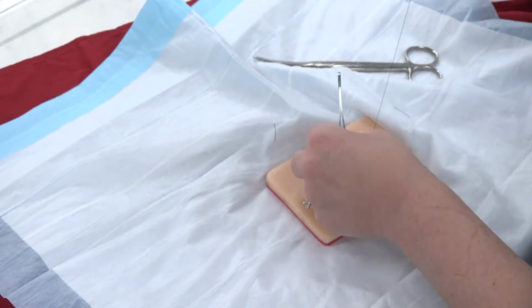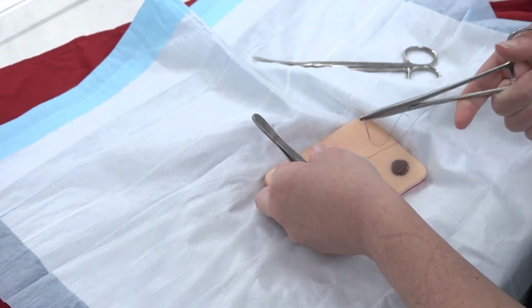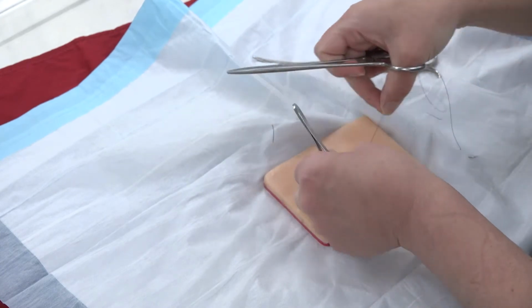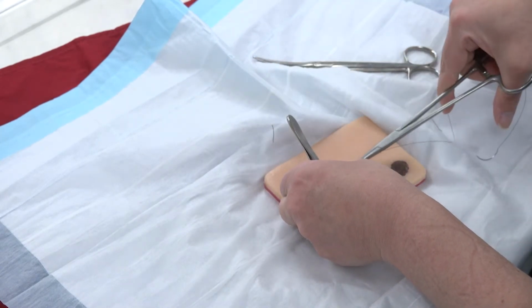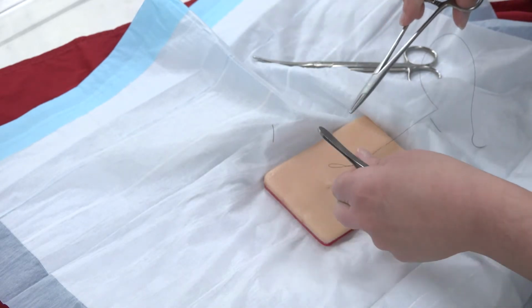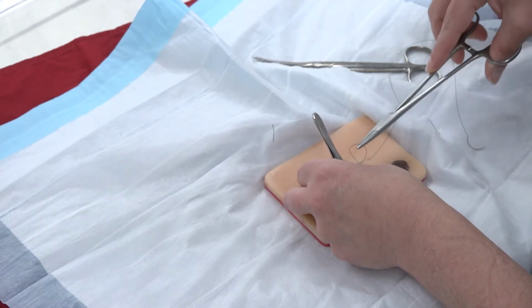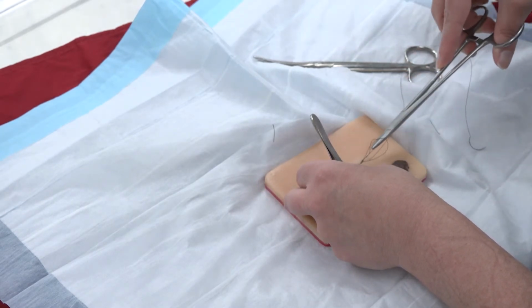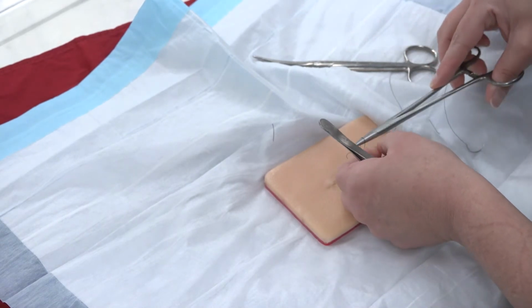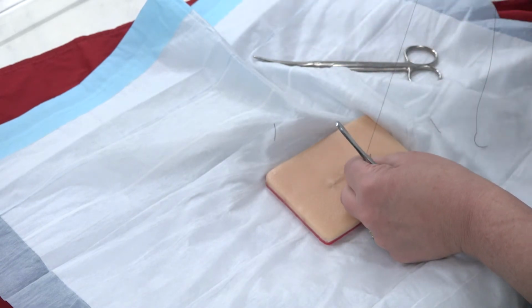and here's another mistake that I just made. So here is my loop that I'm going to tie to. There is the strand that just went across. If I try to tie over the top of this strand right here, it is superficial, and it'll keep my knot superficial. So you need everything on the same side. So I'm going to pull my loop over here to this side. There we go. I'm going to pull my loop onto the same side that I'm going to tie to.